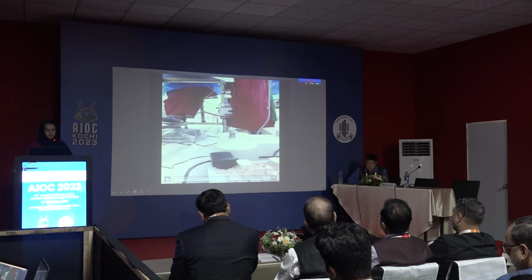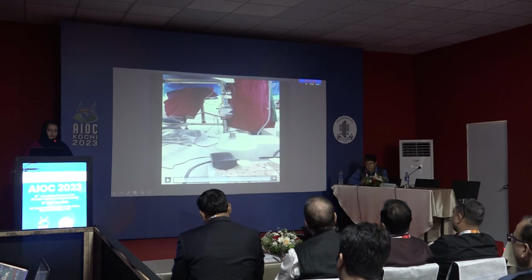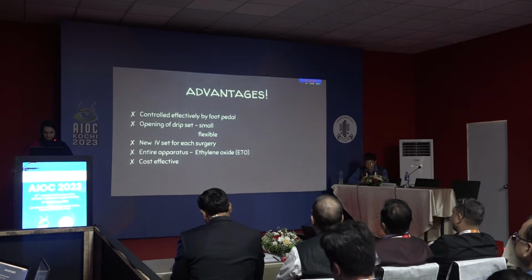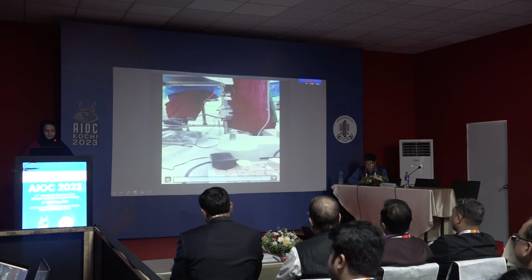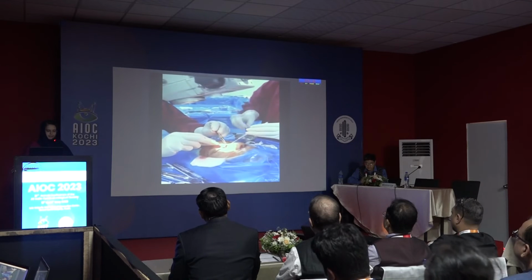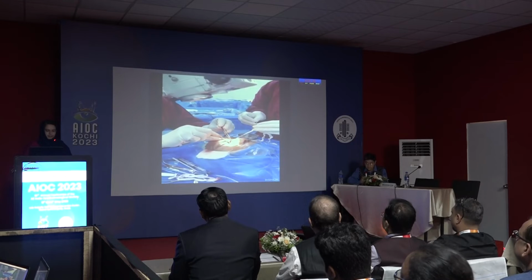And we also attempted to try this in the operation theater in orbital surgery. This is the adapter which is connected to a foot pedal, and this is the motor, and this is the collection bottle, and the bottle is a used saline bottle. And we could see that the apparatus is effectively aspirating the fluid and blood from the surgical field, which may improve the field of view and also reduce the time of surgery.